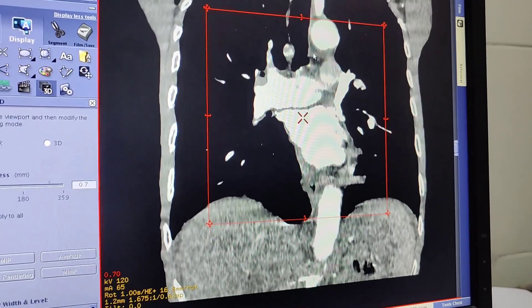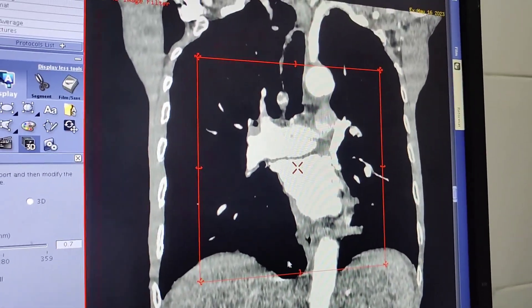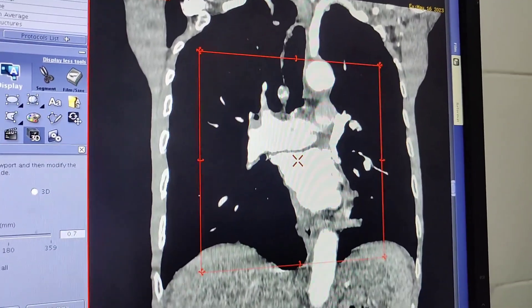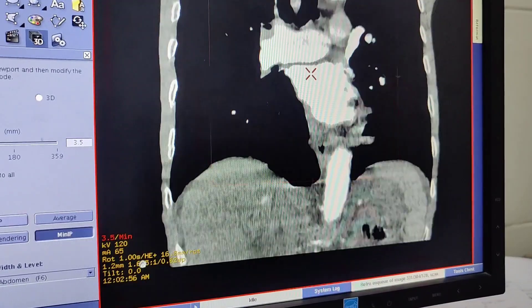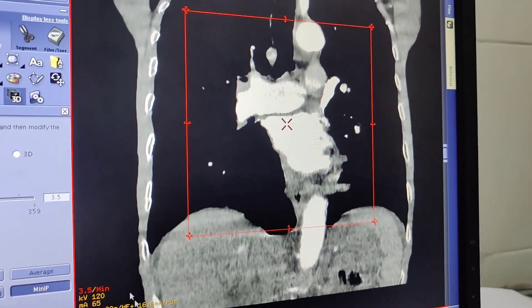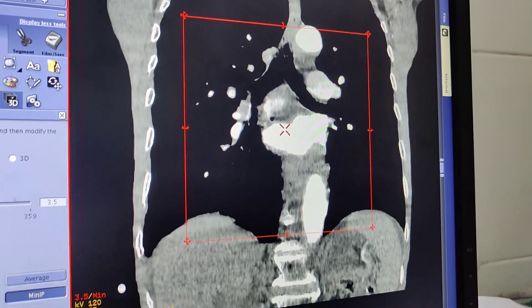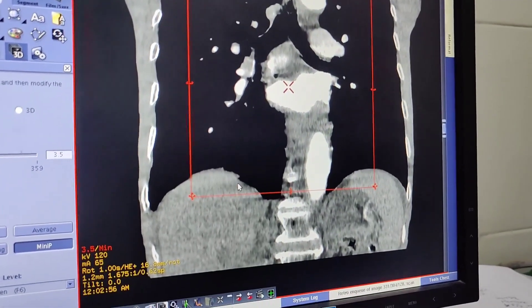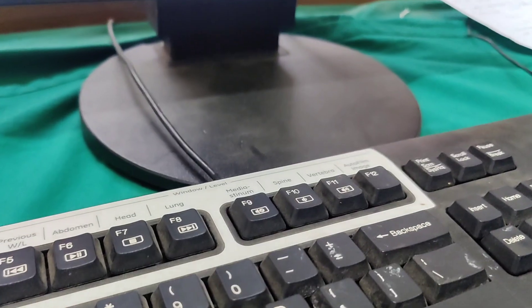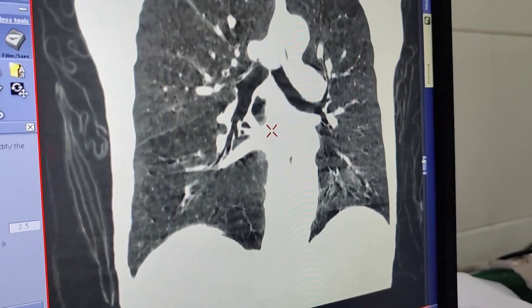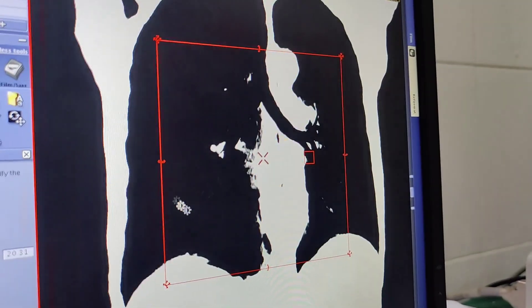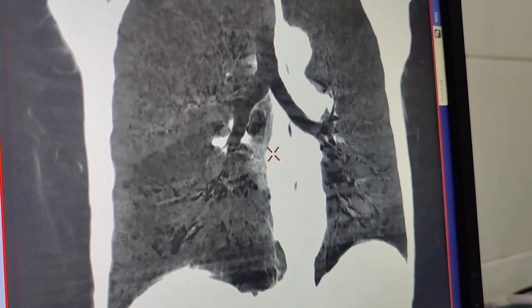Whereas if you're looking at other things — for instance, like your lungs — you want to look at the airways, you're going to change that red portion to minimum intensity projection. So now we're not looking so much at the vessels; we're more looking at the trachea. We change it to a lung window, still on the minimum, and you see how the lungs kind of pop out at you, and you see the trachea very well. That's the minimum intensity projection.